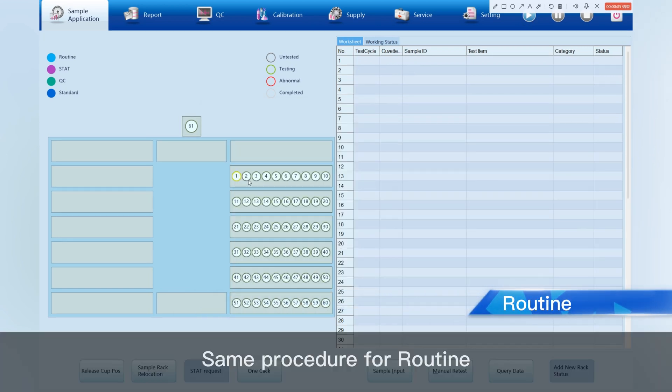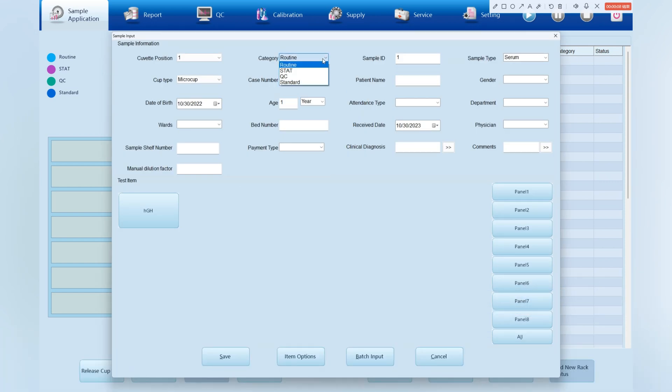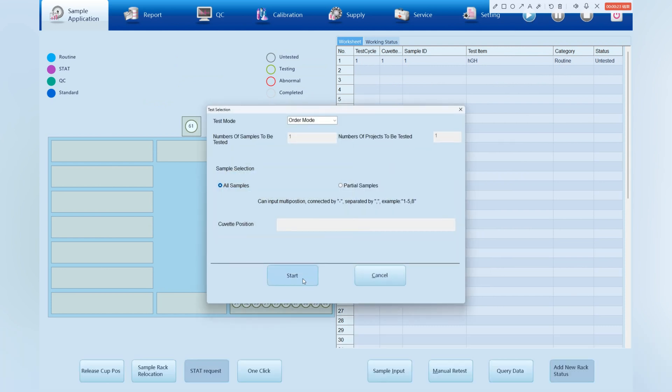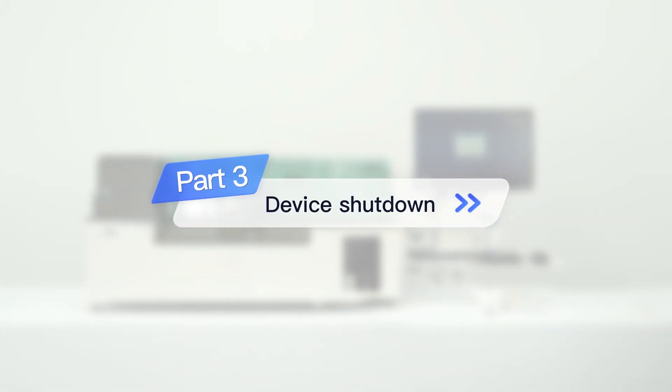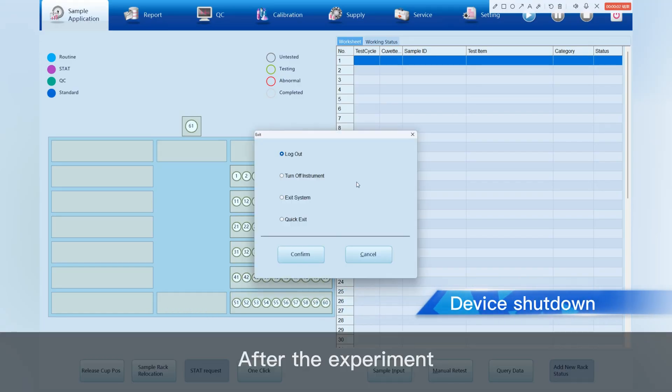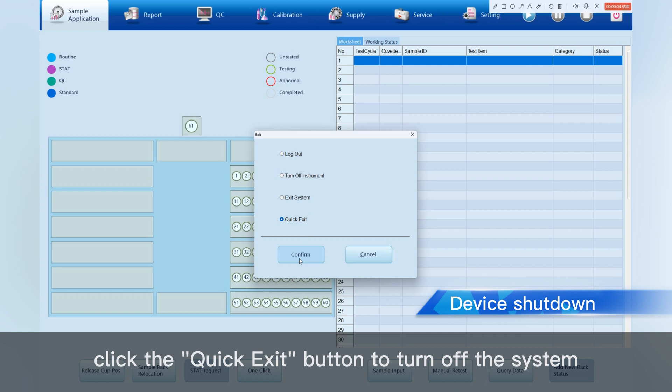Same procedure for routine. After putting in the sample, click Start. After the experiment, click the Quick Exit button to turn off the system.